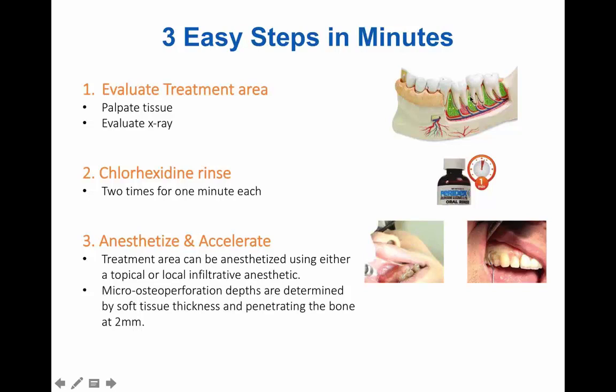And you want to start about 2 to 3 millimeters below the cortical height of bone, and then move apically with your perforations. About 3 per area between the teeth is ideal. I've had many cases where I could only really feel comfortable doing 2 perforations, and that also works well. I try to get 3 as much as I can.